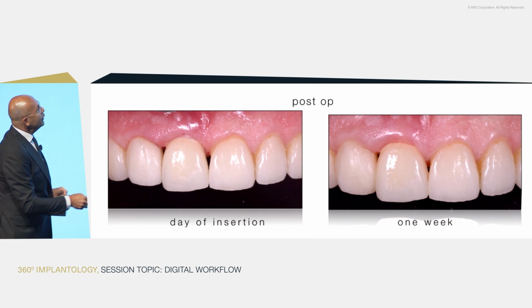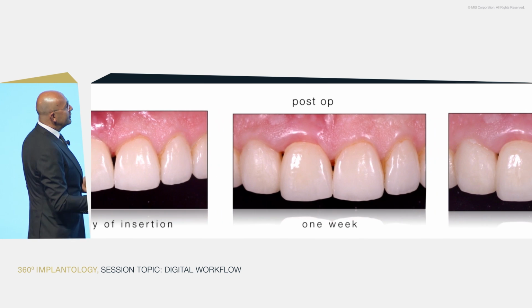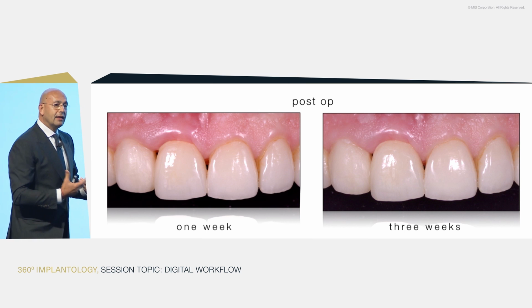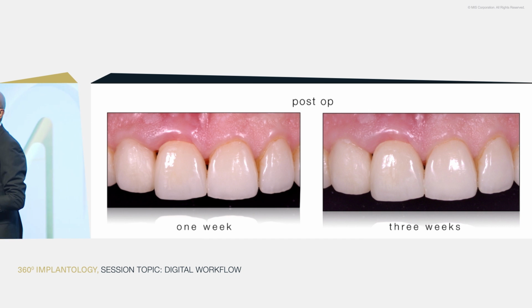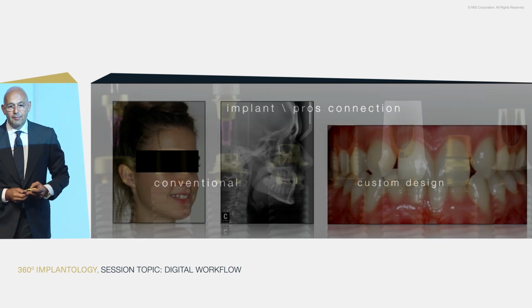And after that, in 1 week, look at the change here. It's just filling up the space. And in like 3 weeks, this is the final result. So if we do the biology right, if we do the denture, the prosthesis right, these are prone to be very, very successful cases.